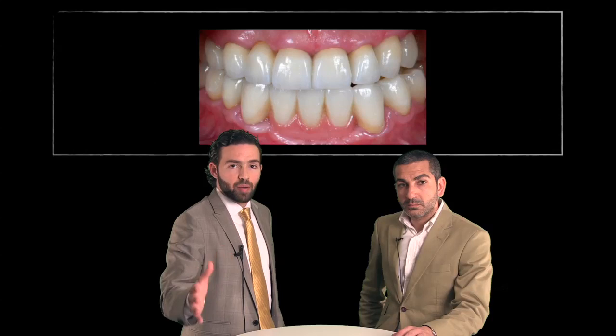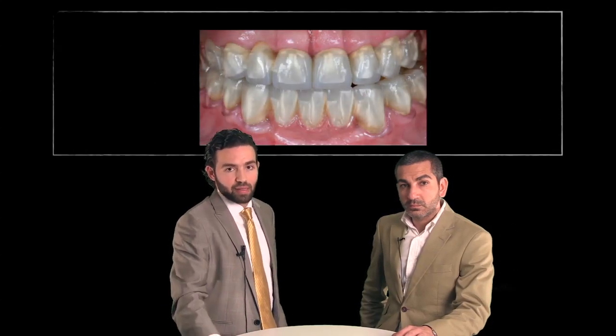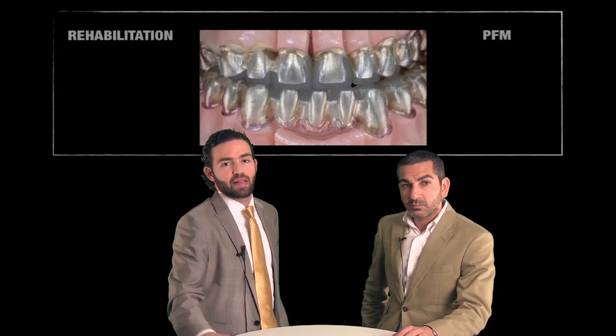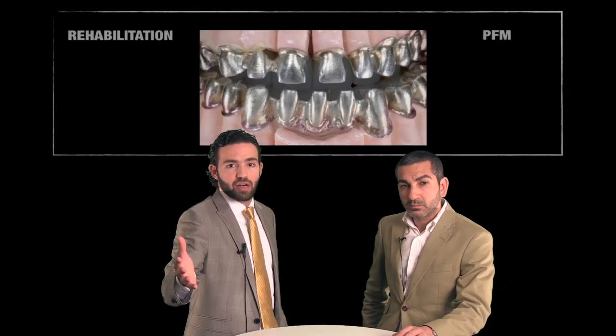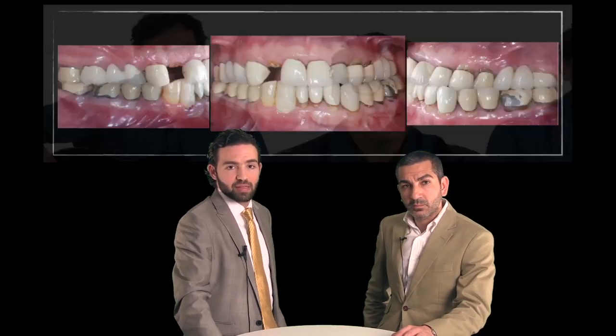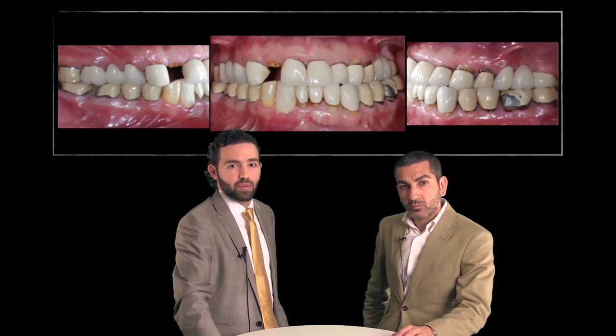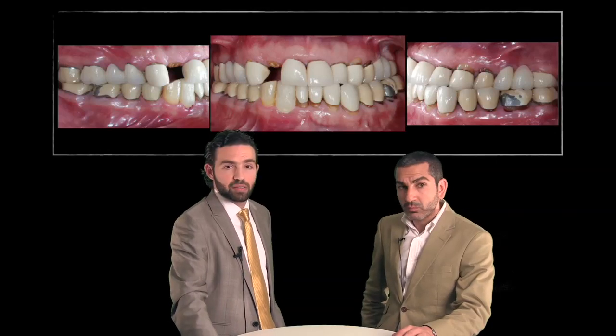A full mouth, complex, comprehensive case using porcelain fused to metal. The underlying substructure is metal. And just to remind you of how the case started, actually, it was all porcelain fused to metal restorations that have been restored and replaced by porcelain fused to metal. They look fantastic in the patient's mouth, and really don't see any complaints in terms of chipping or delamination that often occur with them because of the long track record history of it.